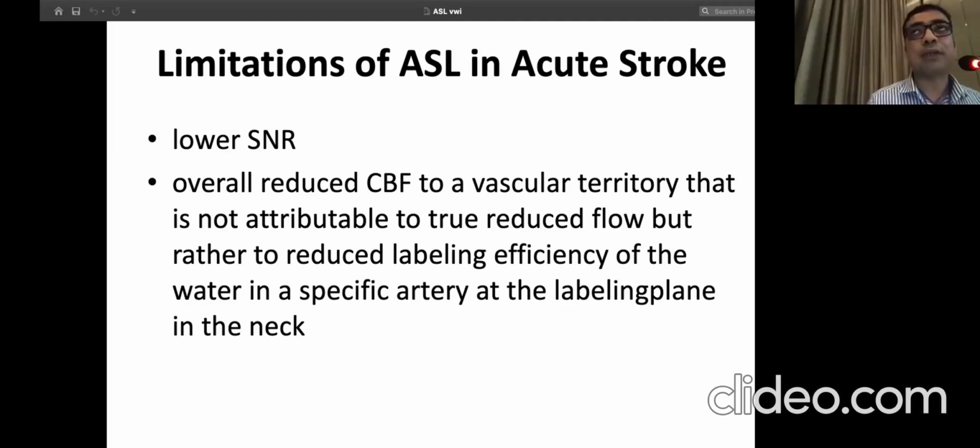So in that aspect, we try to increase the milliseconds of the PLD, the delay, and we were able to get a significant amount of good SNR. As you increase the delay, the SNR goes down. That's what the application guys told us.